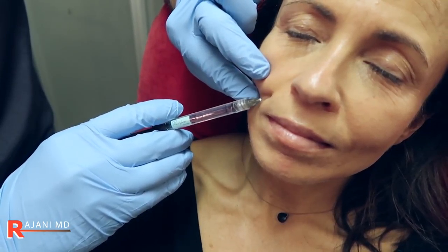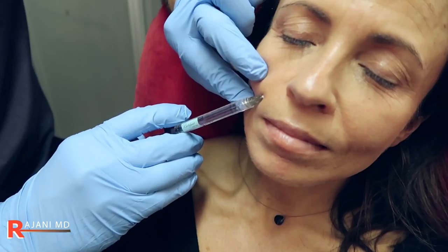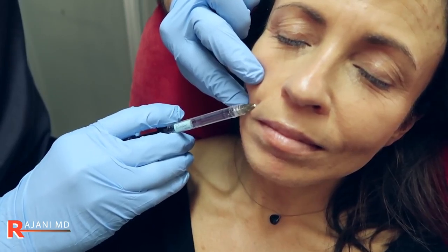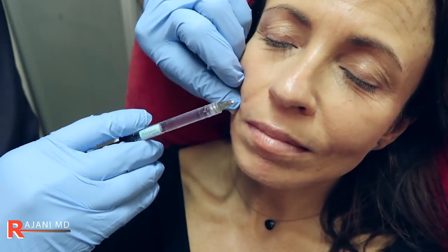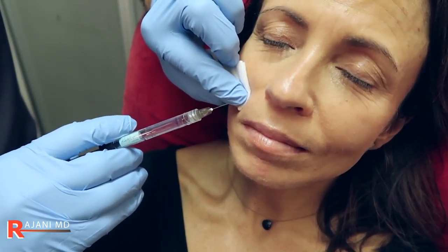Poke coming here — a little stick. And then we're going to do a little antegrade and a little retrograde. We're going to do plasma sculpt on the patient as well today, but we're going to add just a little bit in these nasolabial folds because they're a little dominant. We did do our plasma sculpt last time, but having a little HA in there is going to be helpful.